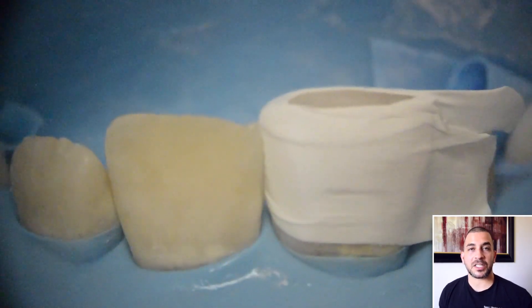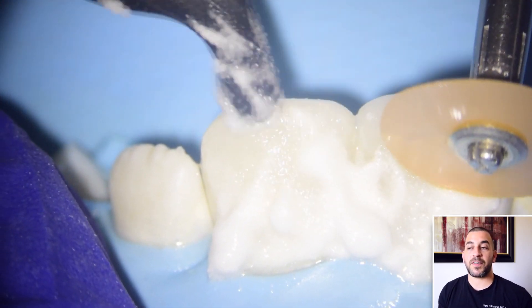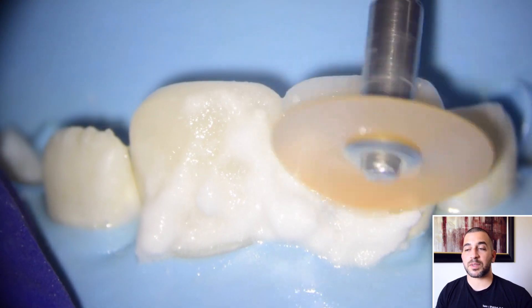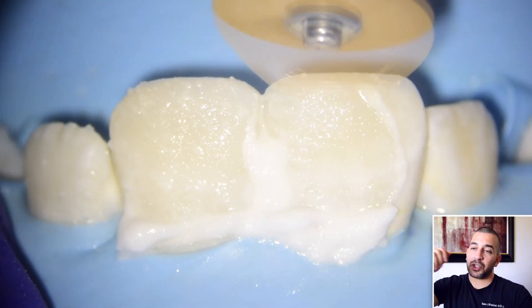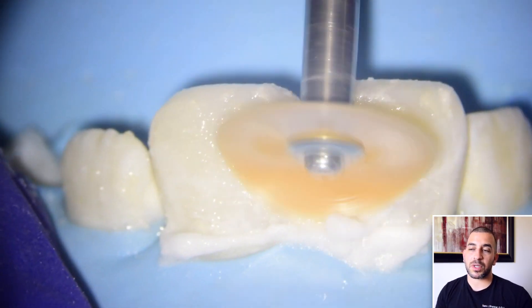One other technique I wanted to illustrate was some of the tools used to finish the polishing at the end of the procedure. What I like to do is put a little bit of aluminum oxide on the facial surface of the tooth and then use my very fine discs to polish or buffer out any of these ledges that are noticeable on the tooth.